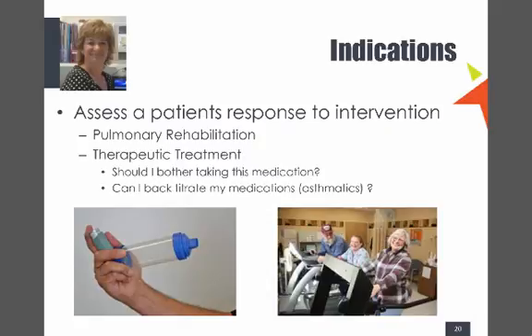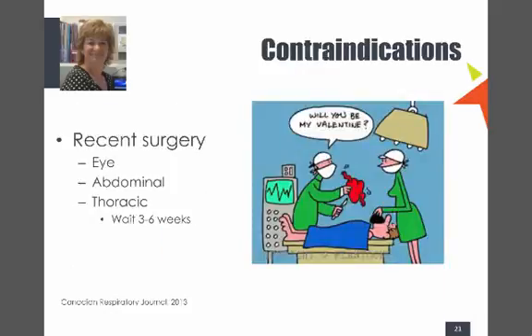I mean, to be honest, I think it's probably more beneficial to really focus on the symptoms and their quality of life. But also with asthmatics, they don't want to be taking 2 puffs of something every day if they feel well. Maybe they don't need to. Maybe we can check the spirometry, drop back the preventers to the lowest dose we can. That is what the guidelines are. Maybe then, we can drop them down, say, yeah, your spirometry is okay. You're not symptomatic. You're not using Ventolin more than 3 times a week. So this is the dose that we need. So we can use it to actually titrate your medications up and down. So why wouldn't you do it?